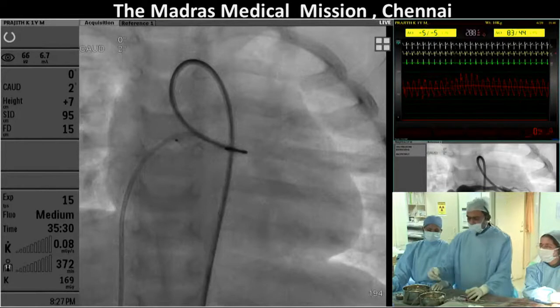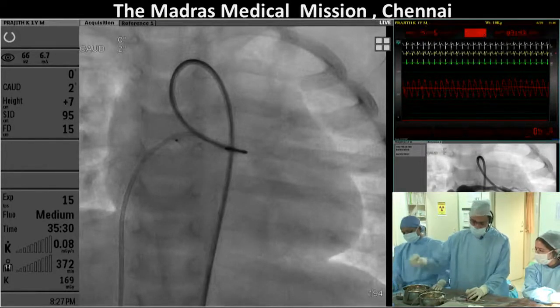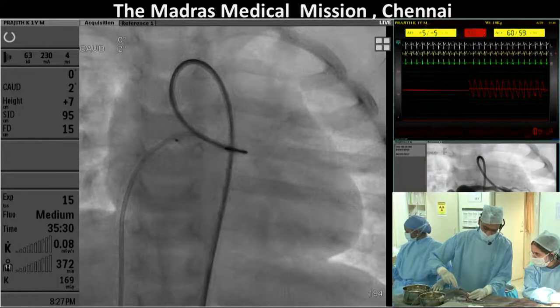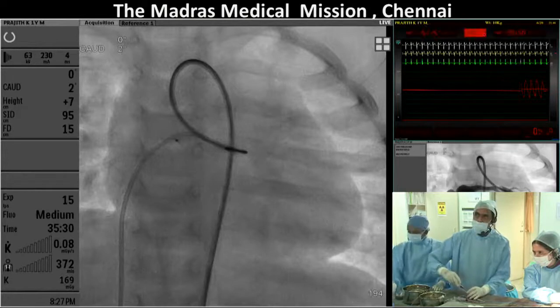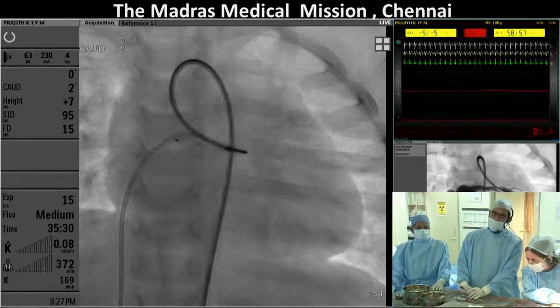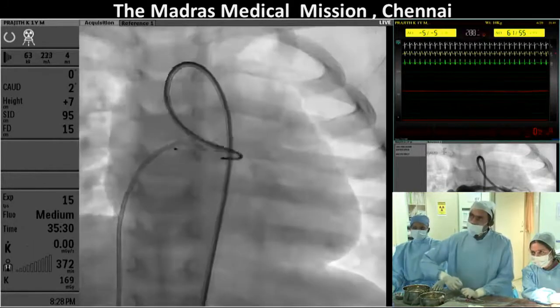Yeah, Dr. Jim. I should have said this earlier. What we just learned is that almost certainly we should have seen a right coronary picture before we did anything else. So if you look at this injection with the plug in, you're now seeing the right coronary film. And I could be wrong about that branch being a sinoatrial node artery, okay? If you shoot the right, most sinoatrial node arteries come from the right coronary.